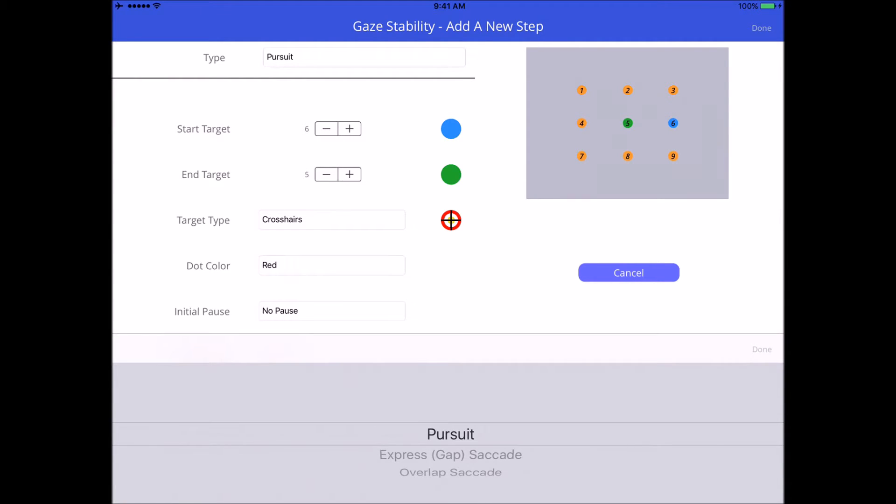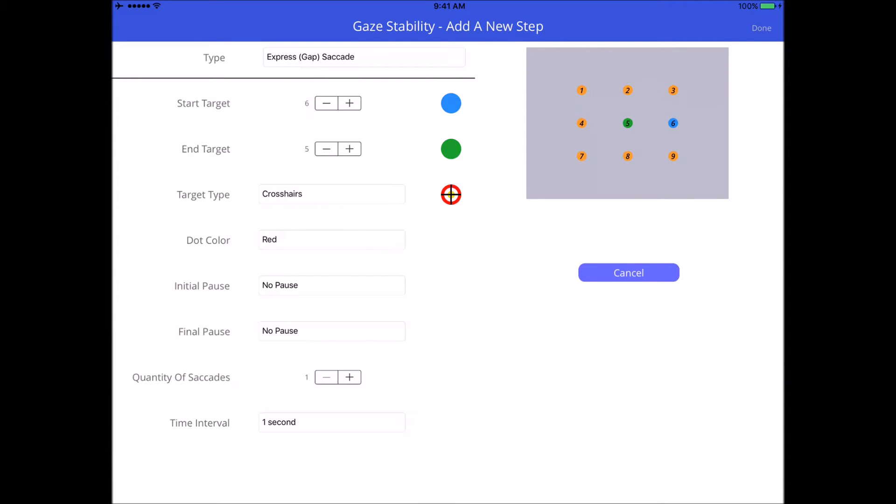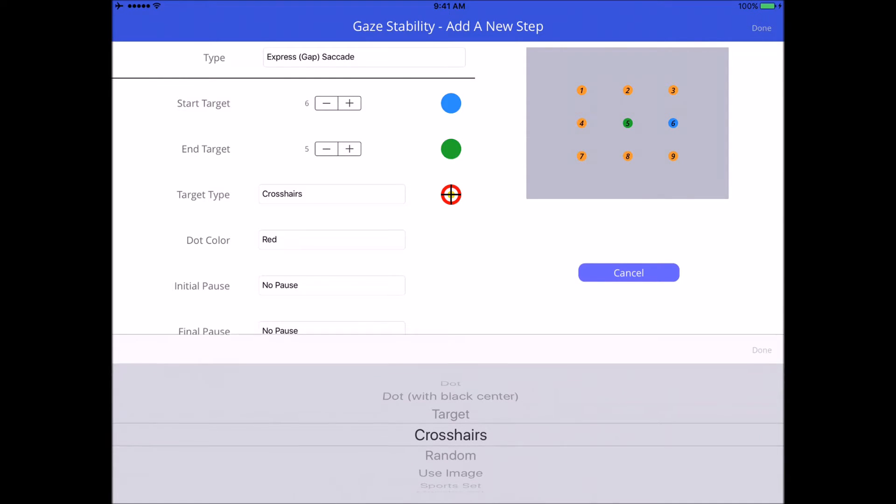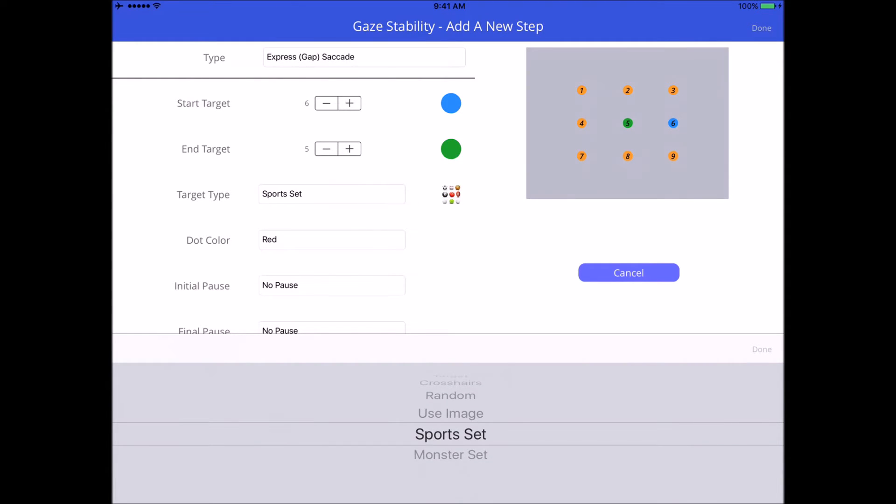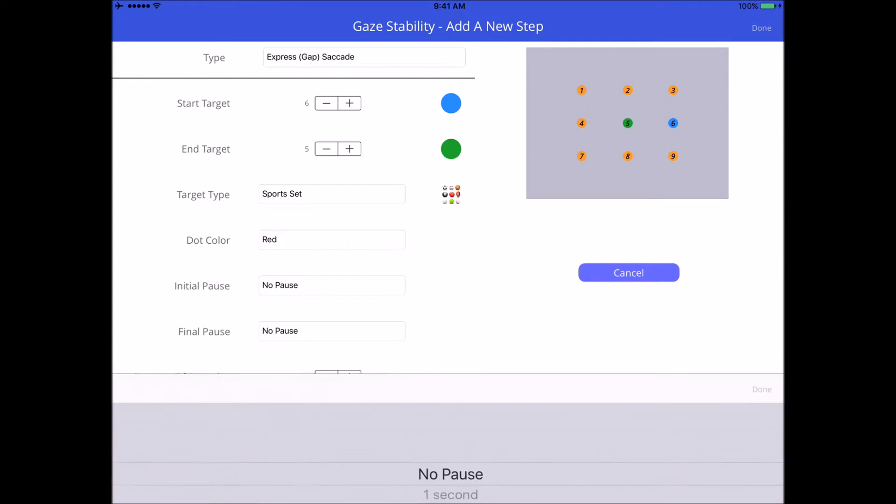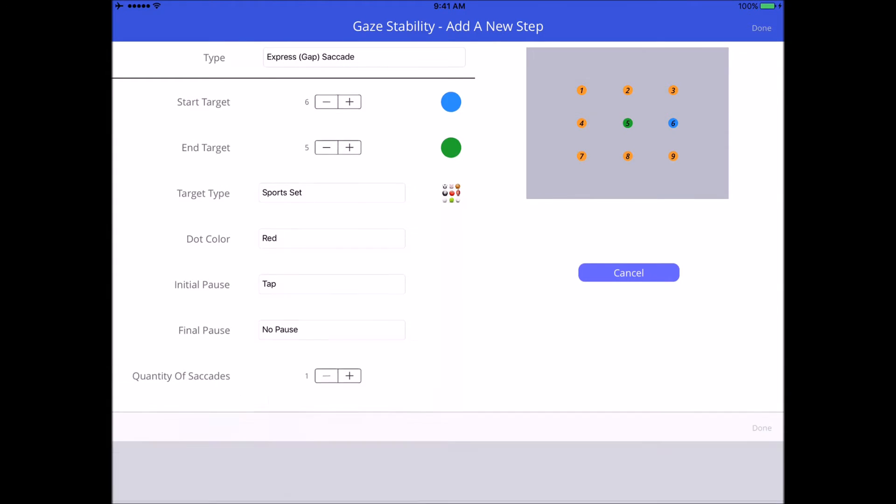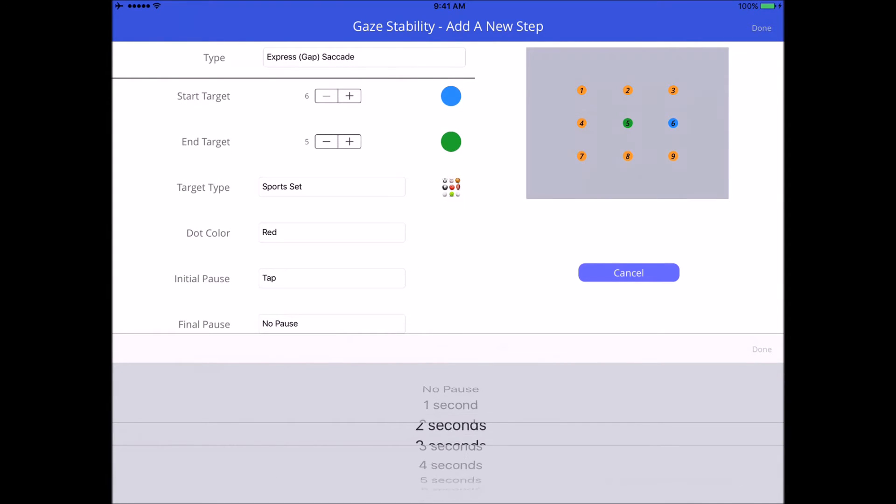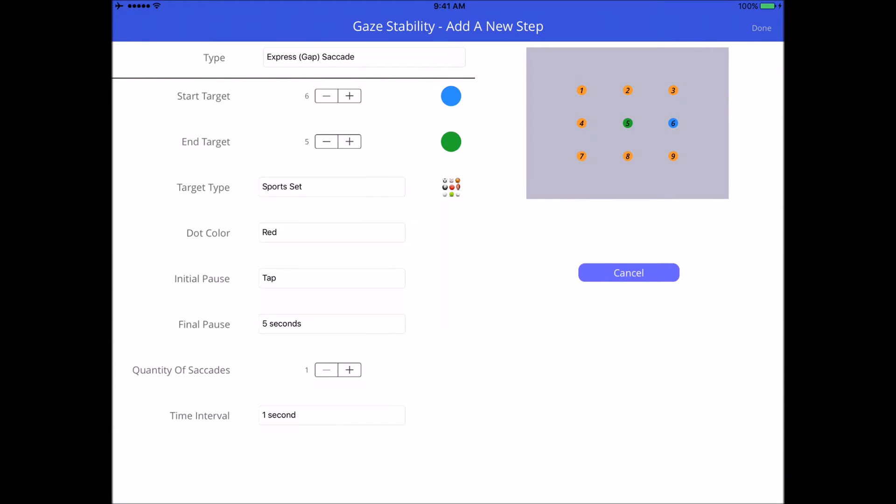I'm going to make it a saccade, and for some reason maybe for this particular patient a pursuit to the right and a saccade to the left is more beneficial. In this case I'll be able to demonstrate what the difference is between the two and what it looks like. I could even change the target type if I wanted to, like have one target going one way and a different target the other way. Let's just use a sports set for this one so you get to see the variety.